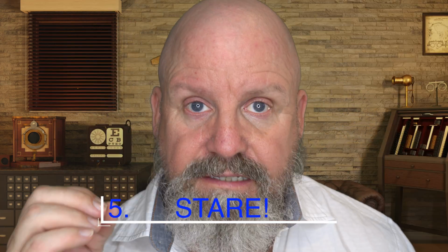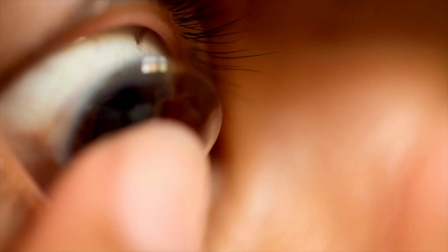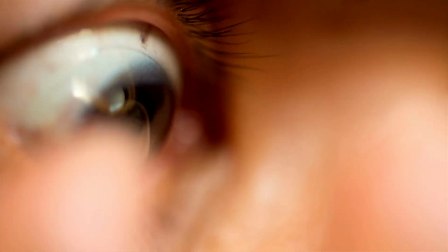Number 5, it's one of the things I always tell the patients, especially early on when they're really having trouble. They get the lens almost on the eye and they blink, and it happens incessantly. So make sure you have that lens pulled up, tilt your head down, and stare. Stare is the next tip, to try to go really slow and just go on, so you don't have that surprise feeling of the lens touching your eye and then you blink and then you're starting all over again.